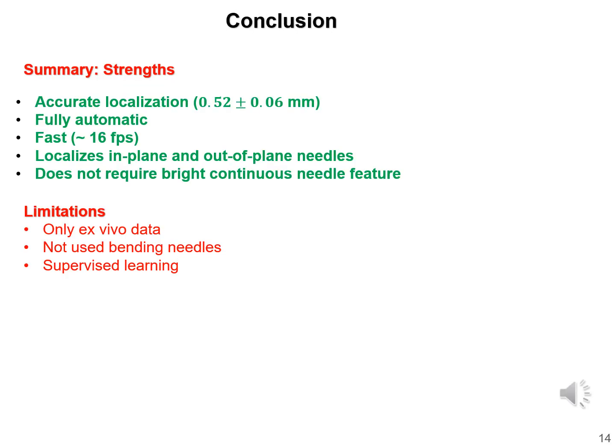In a nutshell, although our method shows good performance, we haven't evaluated it on in vivo data. Thus, in vivo evaluation is still required to fully assess its clinical utility. Furthermore, the needles we used for our data collection experiments exhibit minimal bending, and further evaluation is required on data collected with small bending needles. Lastly, our approach utilizes supervised learning, which requires the labeling of the needle tip location. And a clinical evaluation requires the collection and labeling of large-scale data, which is quite a time-consuming procedure. So as part of our future work, we'll also investigate using a semi-supervised learning method to limit the annotation effort.